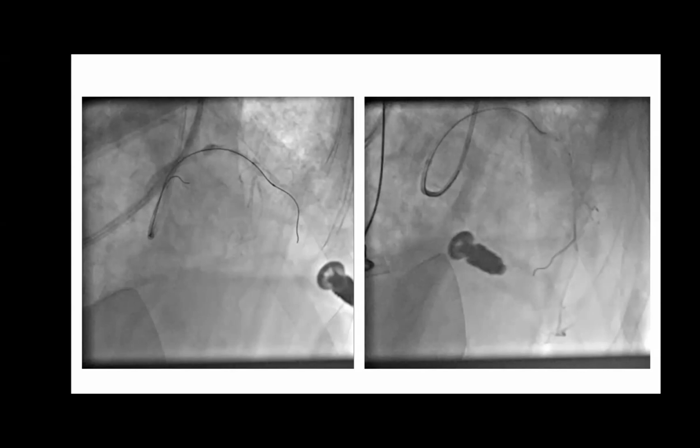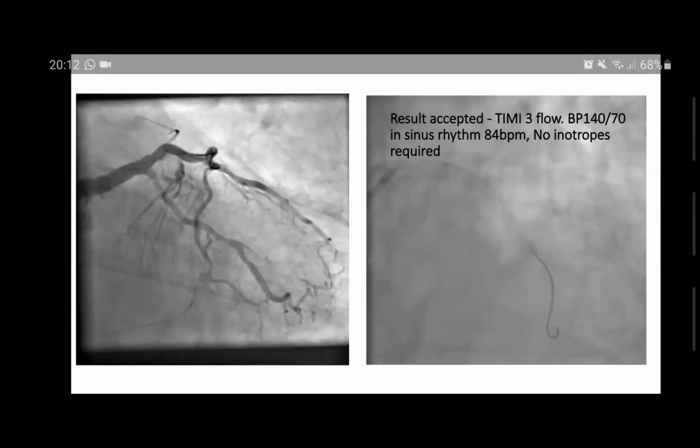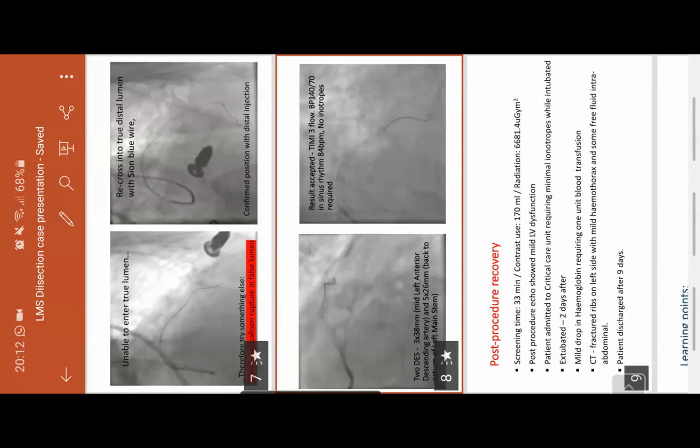Yeah, I mean, it was a soft lesion, isn't it? So it could have punctured back in the proximal segment. The other thought in my mind was having a Stingray system, for example, as if you're doing CTOs, that would have been quite useful there as well. But I think the problem here is that if you look at the left main stem, it is ginormous. I don't want Shoaib to go back because otherwise the screen will crash again.